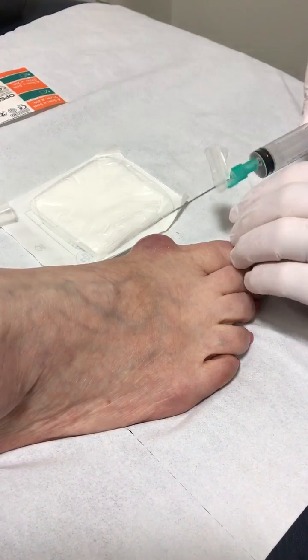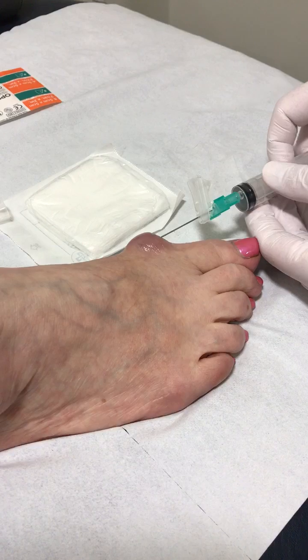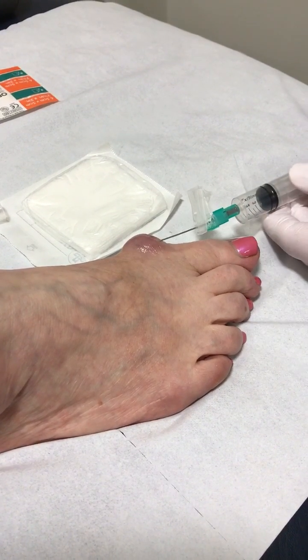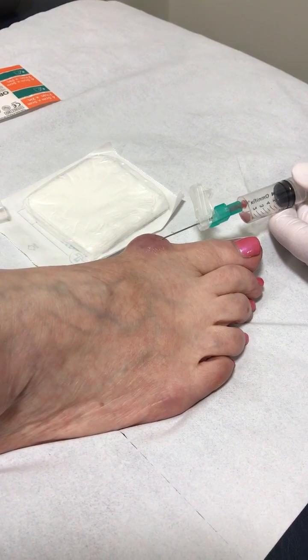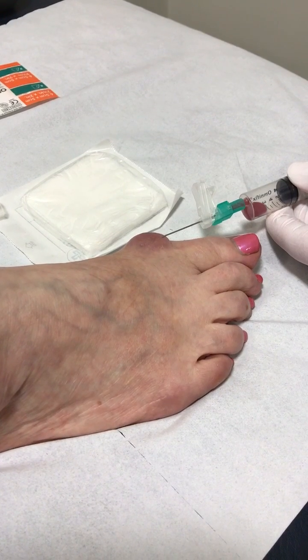Okay, so a little scratch coming up — three, two... never get to three. You do have to put quite a bit of pressure on sometimes to get them out. It's just started to come there now.